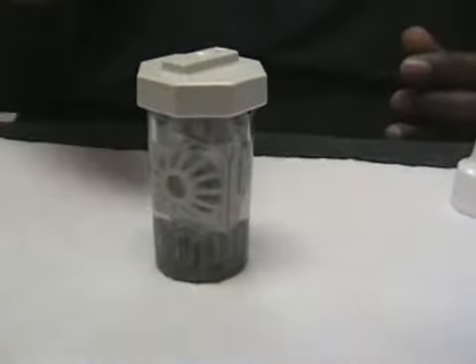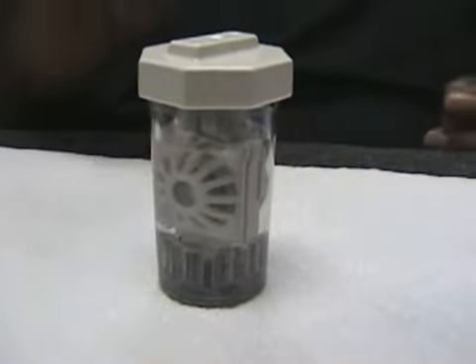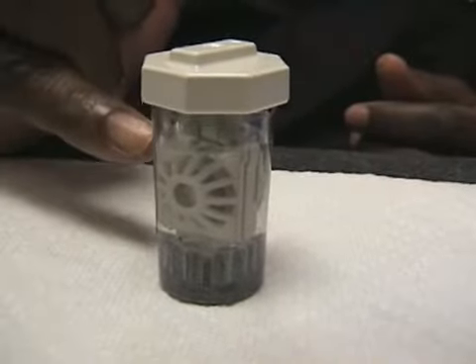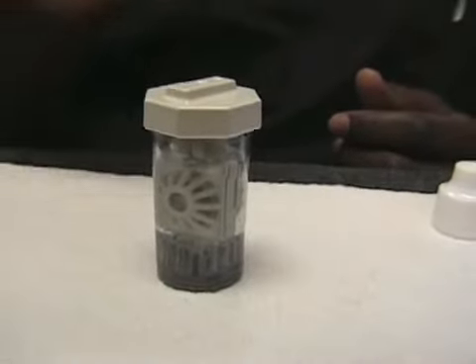You need to make sure that you leave your contact lens, in this case, in the solution for 6 hours. What happens is, after the 6 hours, it turns the dirty solution into clean, sterile saline solution. So you can actually take your contact lens directly out of here. After the 6 hours, it has to be 6 hours. But after the 6 hours, you can take your contact lens out of solution and put it directly in your eye.